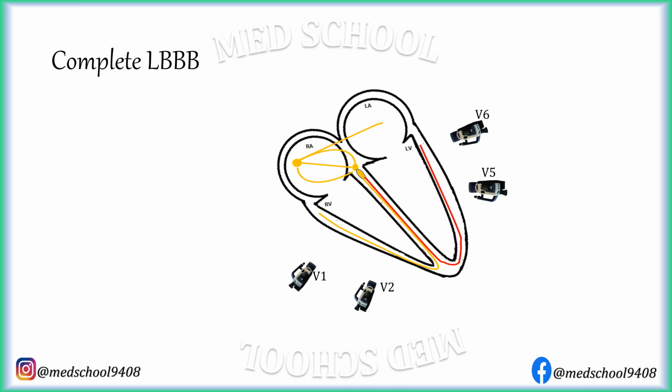Firstly, septum will be activated from right to left instead of left to right with erratic conduction. Secondly, as septal activation is slightly delayed, it occurs simultaneously with activation of right ventricle. As ventricular septum is more muscular than right ventricle, combined vector of these two vectors is also directed toward left. This will cause a negative deflection in right-oriented leads and positive deflection in left-oriented leads.